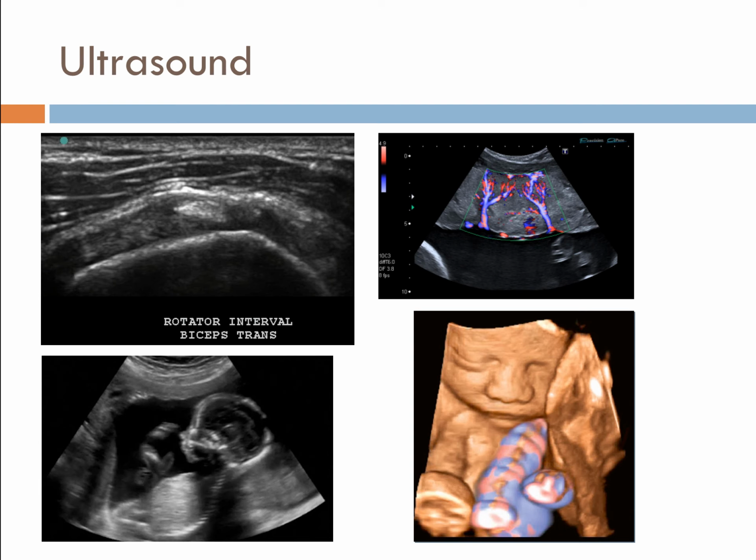coming on the scene now to look at microvascular intrusions into ligaments and trying to find ligaments that are damaged, like that Achilles tendon, but maybe even a bit earlier than that. So looking at tendons and ligaments before they actually rupture or before they get into significant disease. And the engineering behind ultrasound is becoming increasingly used for that. And you see down the bottom, ultrasound's obviously used for gestational imaging as well.